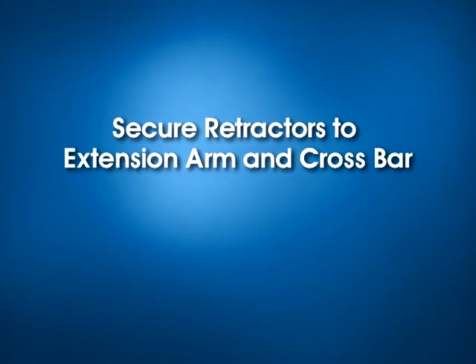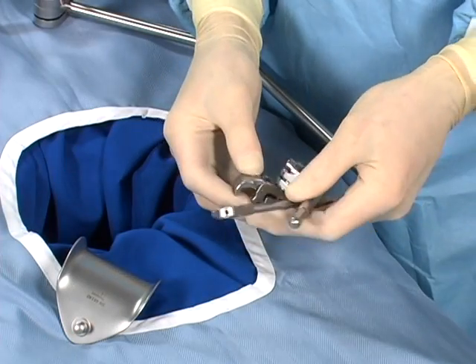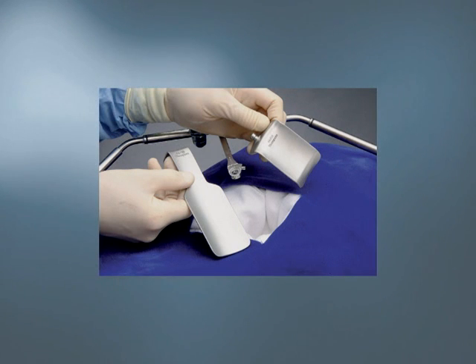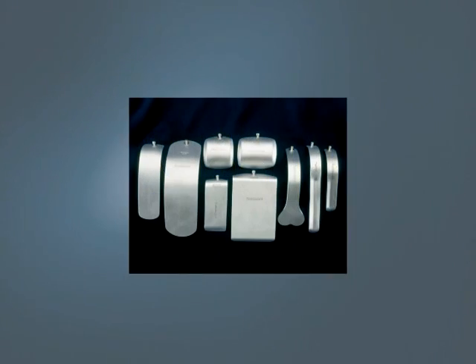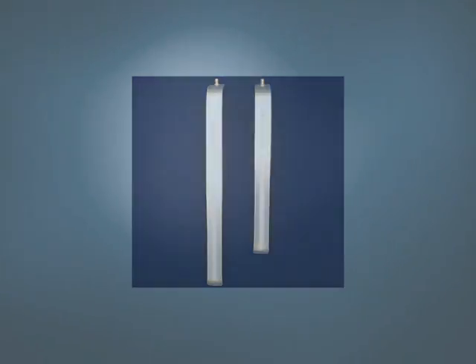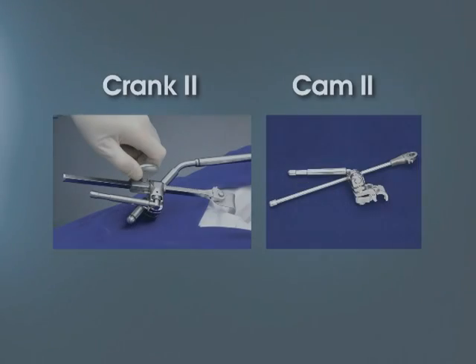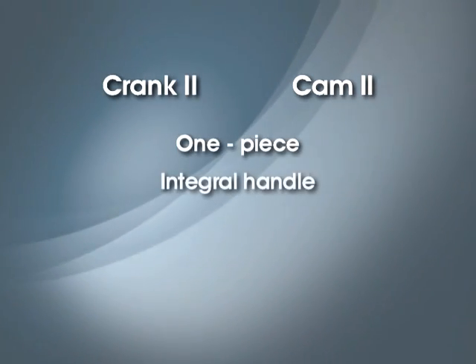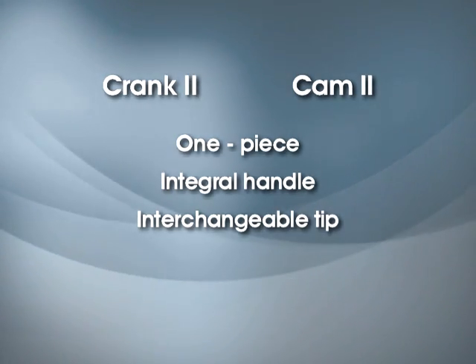Now that the frame is in place, the retractor blades can be positioned. The design of the crossbar and extension arm allow retractors to be mounted directly to either bar. Select the appropriate blade and one-piece joint with handle. Thomson Surgical has over 200 retractor blades in stock. If you can't find the blade you want, please contact us. Thomson Surgical provides custom retractors and frame components per your specifications. The most up-to-date innovations are the Crank 2 and Cam 2 clip-on joints with handles. All joints are one piece and include an integral handle with interchangeable tip, compatible with any of Thomson Surgical's 200 blade patterns.